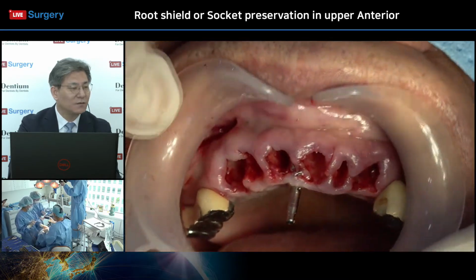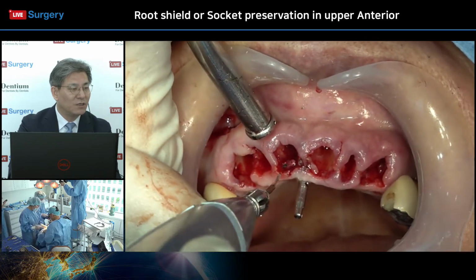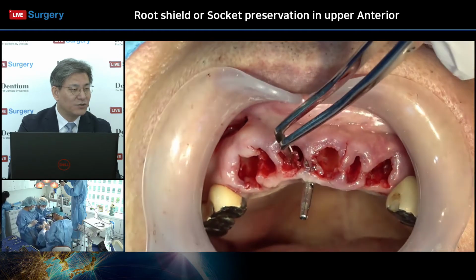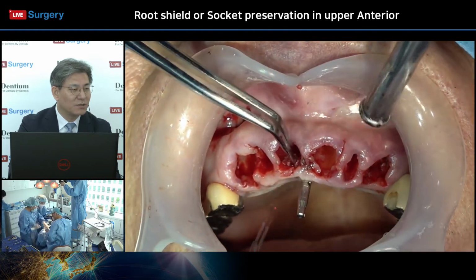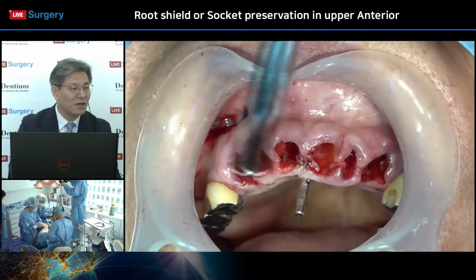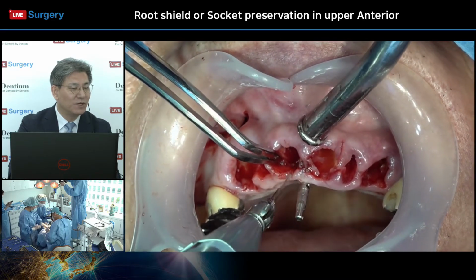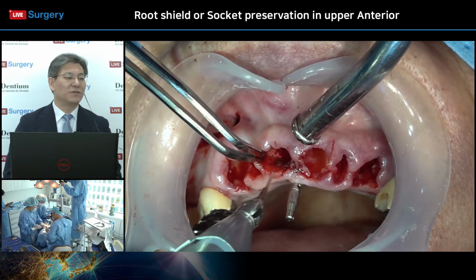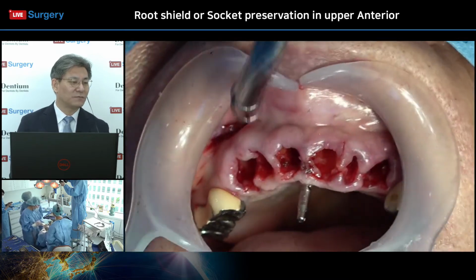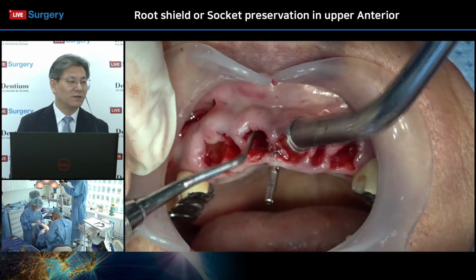Okay, so before implantation, he needs more. Yeah, he used the laser, removing the soft tissues. This K2 laser is versatile. Sometimes this laser is used to remove soft tissues and for detoxification. And there are many different kinds of modes available.